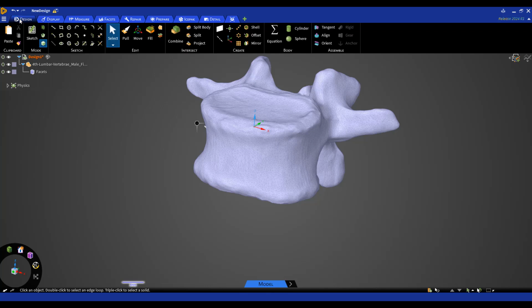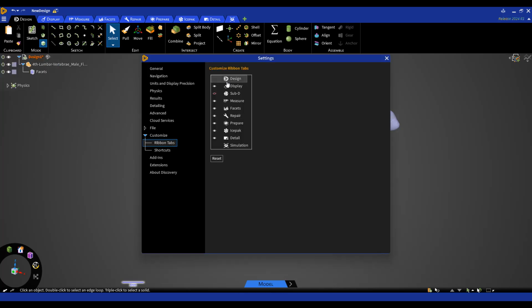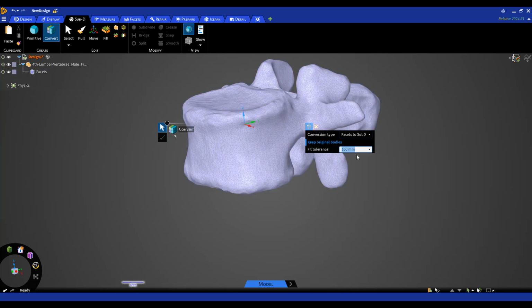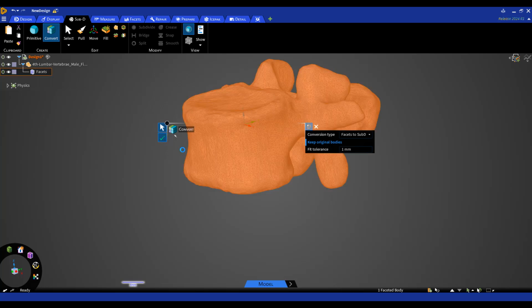In the latest release of Discovery, we have something called SubD modeling, subdivision modeling. So if you don't have that option on your toolbar, we go to Customize Settings, Customize Ribbons, and turn on my SubD branch. This gives me the ability to see subdivision options here. And I have the option to convert this model from a facet geometry into a SubD model with 1 millimeter of tolerance. So I hit OK here. And it's going to try to convert this large STL into a CAD model for me. It's much easier to handle.